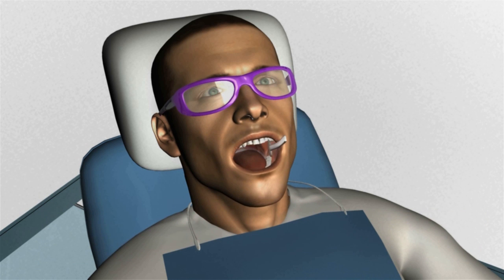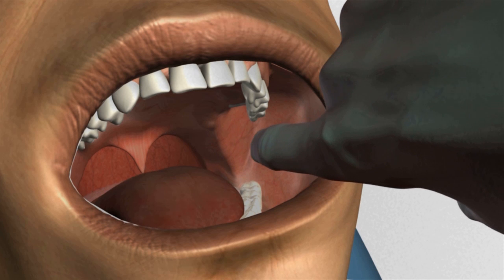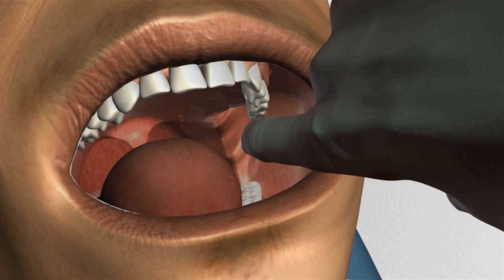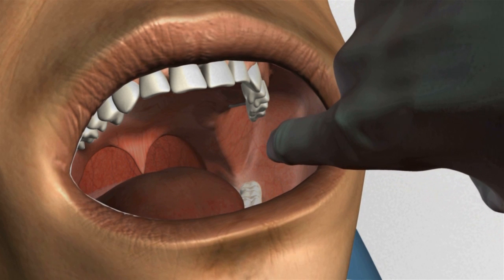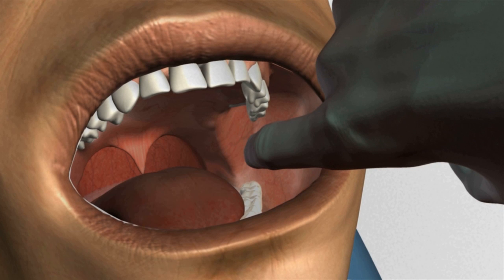With the patient's mouth open, begin by identifying critical anatomic landmarks. For these injections, note the anterior border of the ramus and the pterygomandibular raphe. These landmarks will help establish the triangle for the needle entry for the inferior alveolar and lingual blocks. You may palpate these landmarks as well as the coronoid notch. All of this will help locate the underlying inferior alveolar neurovascular bundle and lingula, though you cannot visualize them in your patient. In our virtual setting, let's examine the underlying anatomy.